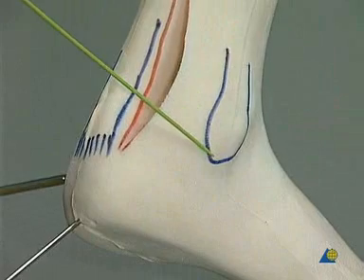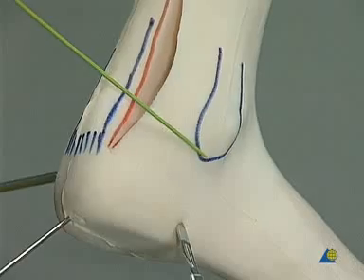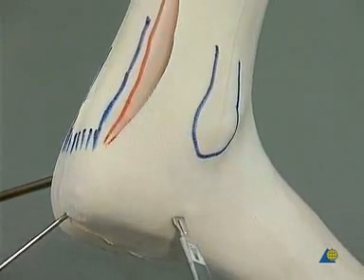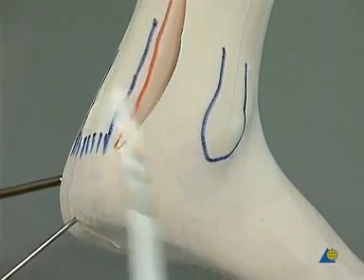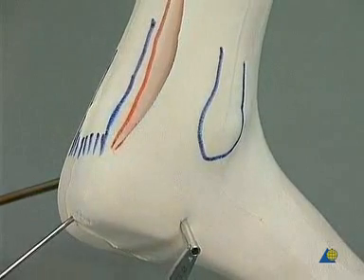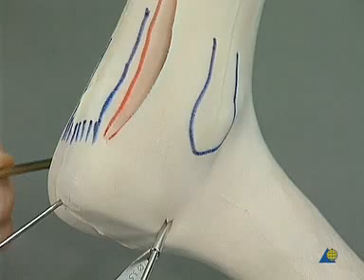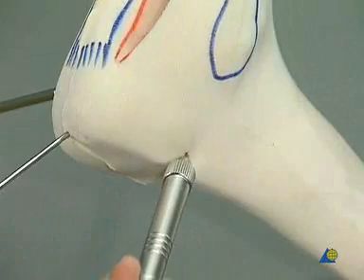Slightly anterior to the tip of the lateral malleolus, a stab incision is made in the lateral edge of the foot. The drill guide is introduced, and using the 3.5 mm drill bit, a hole is drilled from the anterior process of the calcaneus to the neck of the talus. The depth is measured.